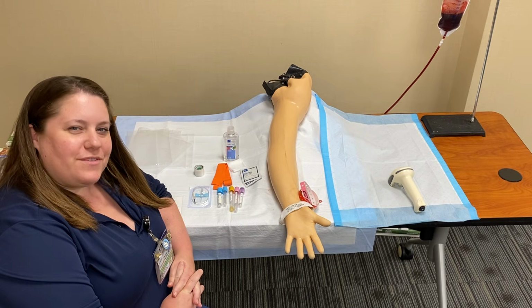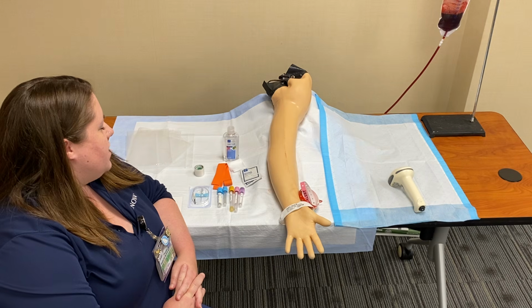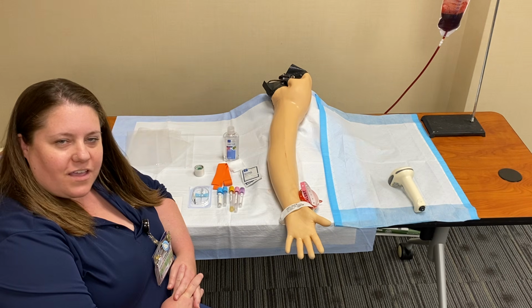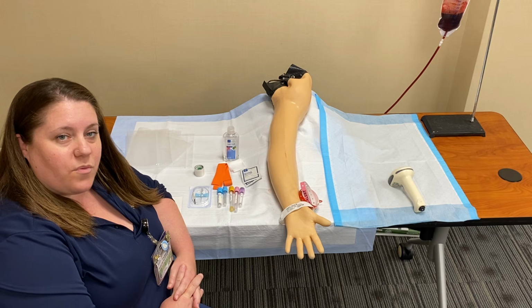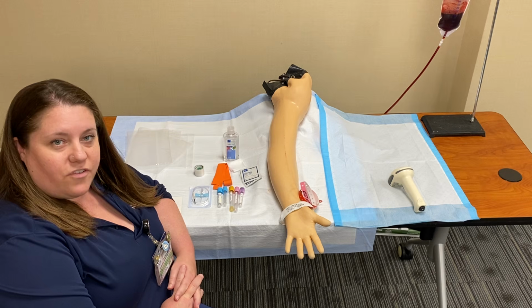Hello, and welcome to Phlebotomy, Butterfly Vacutainer Method. I'm going to demonstrate to you the proper way to use the butterfly vacutainer method to obtain blood samples from a patient. The first thing that I want to do is receive delegation from the nurse.